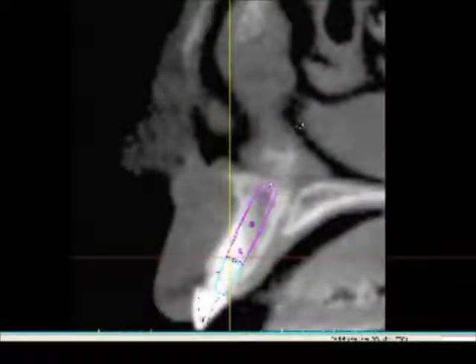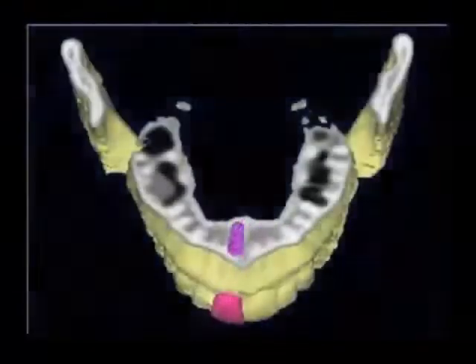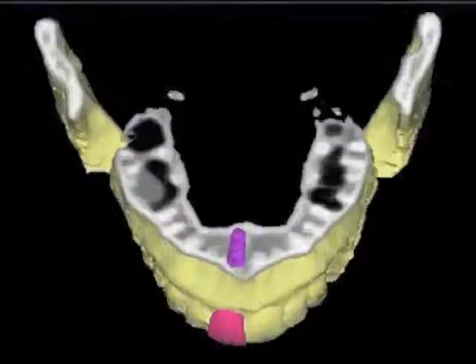I'm going to take you through today's immediate replacement of a hopeless fractured maxillary central incisor. We're going to be showing you how we utilize CT scan technology to plan the case, from the size and shape of the implant all the way through to abutment selection and also the location of the final axial cuts in terms of screw access and abutment and temporization profiles.